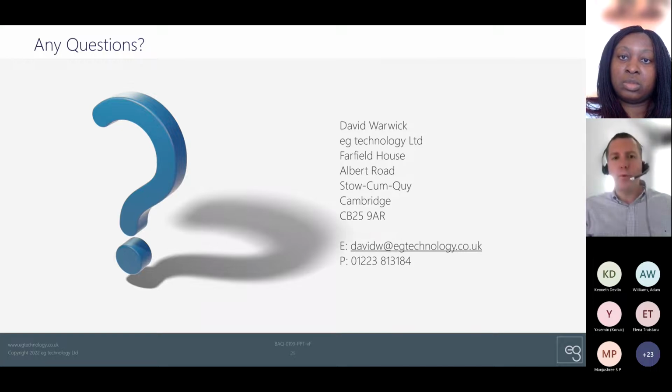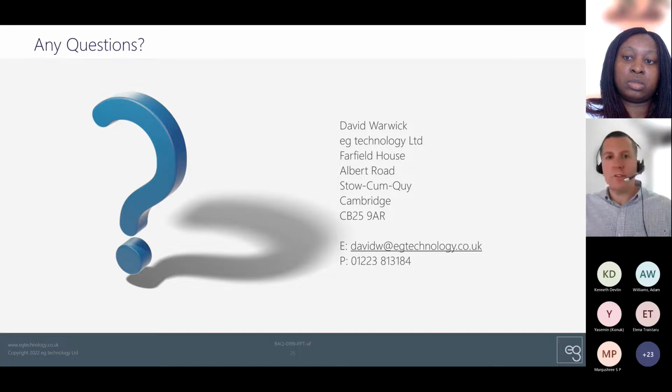So in a very broad sense, the safety and efficacy of the medical device itself is not going to be too concerned with privacy and security. But of course, GDPR is a legislative requirement, as is the medical device regulation. So if you've got that identifiable data, if you're keeping that, then you do need to make sure that you've covered off those areas. And the cybersecurity guidance covers a really broad gamut of things, because they're obviously concerned about particular attacks, disabling devices, all of those sorts of things, but they're also worried about security breaches of patient data and all of those sorts of things as well.